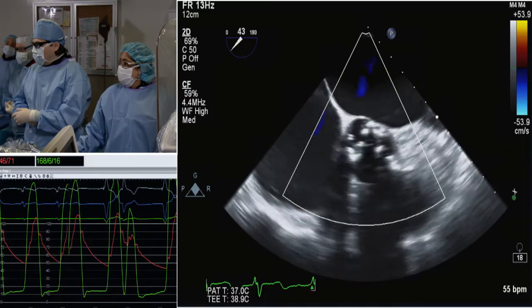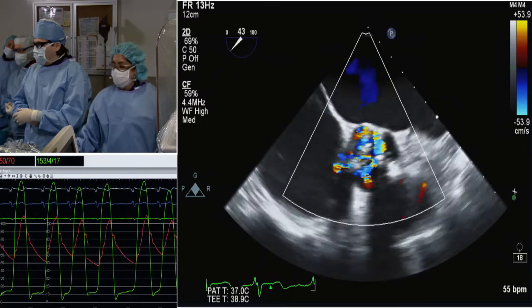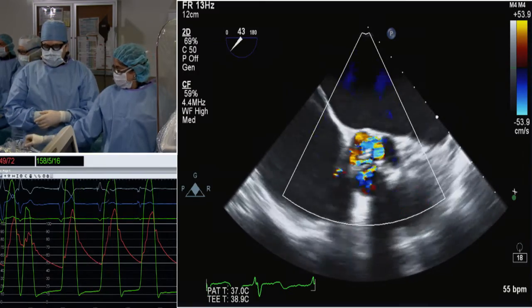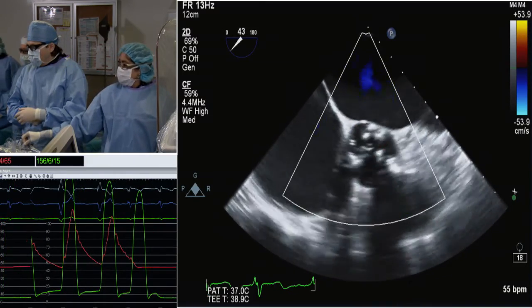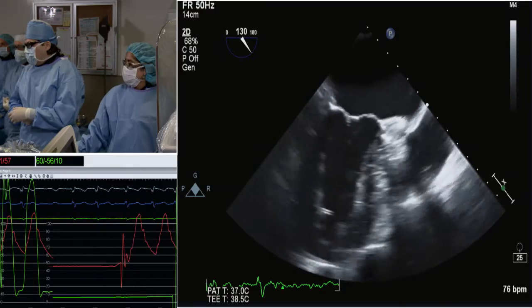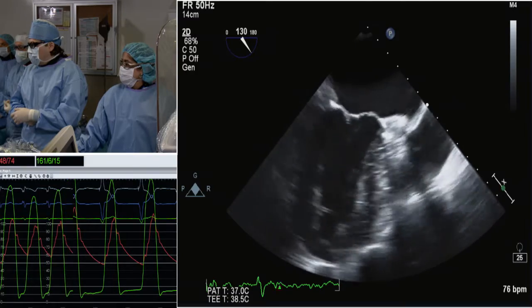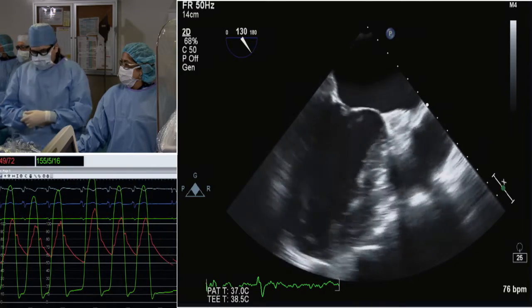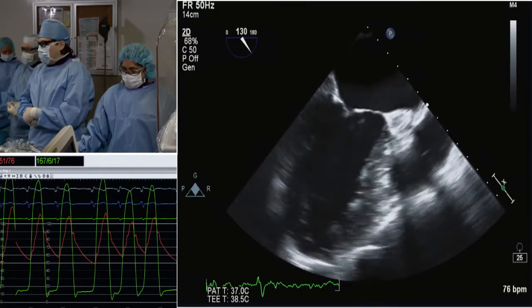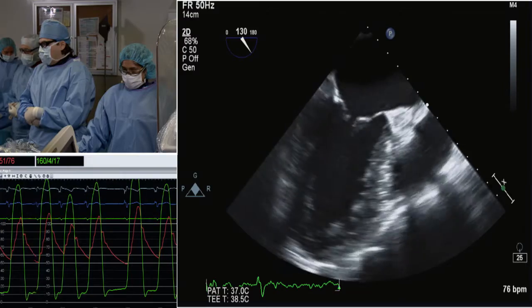Knowing that this patient has heart failure and LV dysfunction, would you consider the eccentricity and the LV function to choose your valve? Yes, this is certainly one type of case in our program where we would have considered a Lotus transcatheter valve, based on the eccentricity and also the potential absence of rapid pacing during deployment for the LV dysfunction. Although we all know that most of these patients recover quite well from rapid pacing, you all have in mind the occasional case where rapid pacing has induced some stunning, and it's a bit difficult to recover the hemodynamics after.